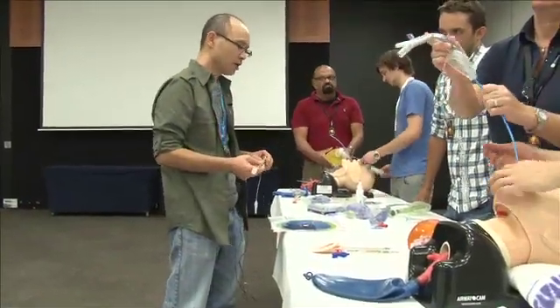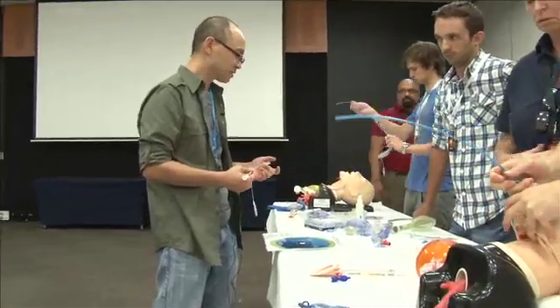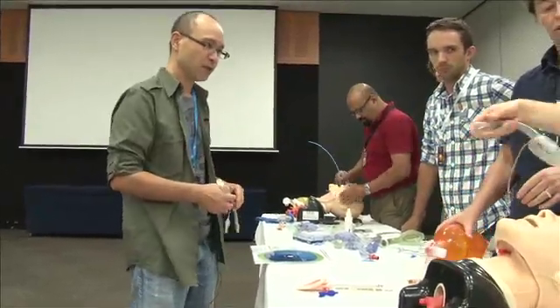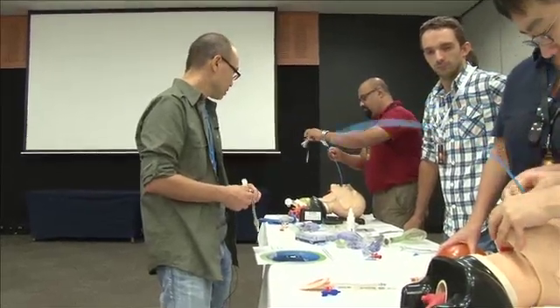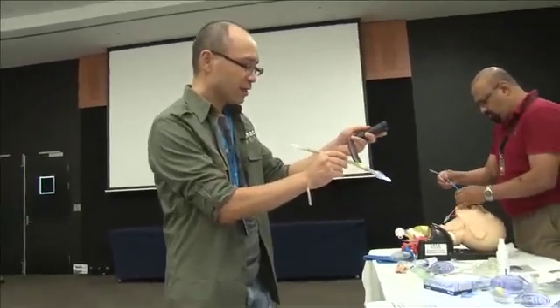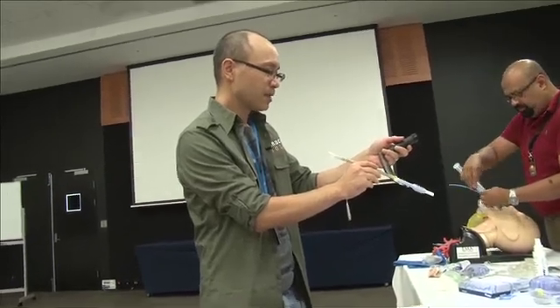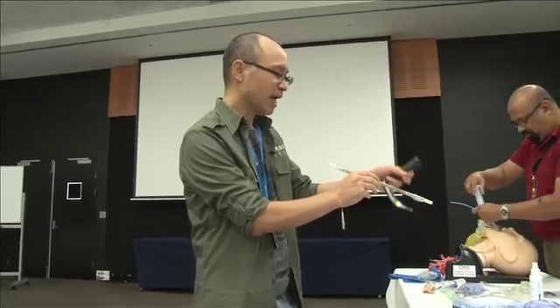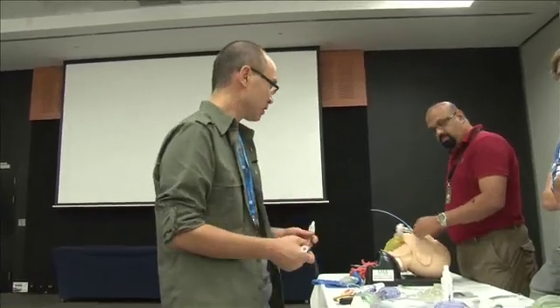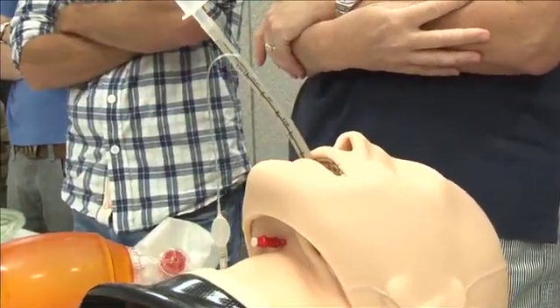In the situation where you either don't have an LMA, it's failed, it's not the right size, or it's not working - there has been an improvised technique described in the literature, which I've used twice, where you can use an endotracheal tube as an improvised supraglottic. Basically the idea is that you've been trying to intubate and you can't get it in. Just remember, you've got a cuffed airway down there already. So if you just place it in the posterior pharynx and inflate the cuff, that acts as a form of a supraglottic airway. Try inflating the cuff and see if you can ventilate the mannequin with that.